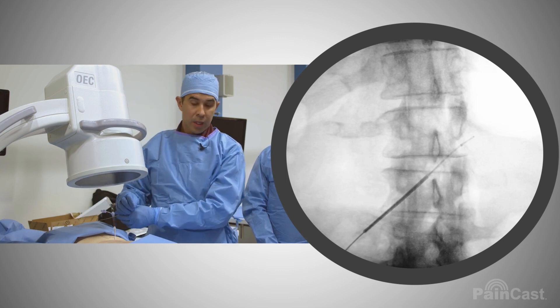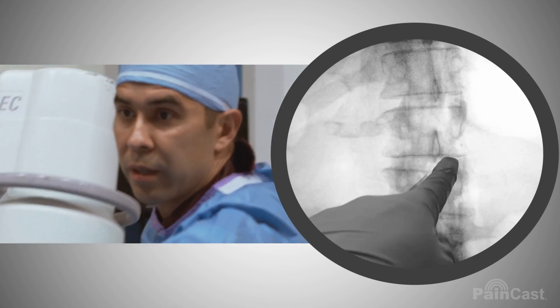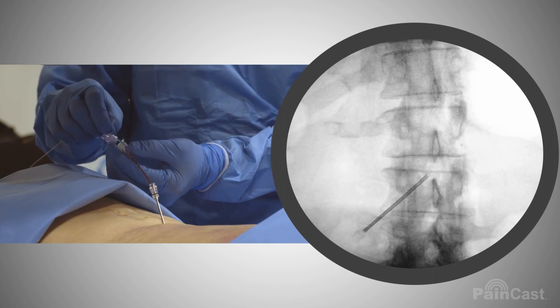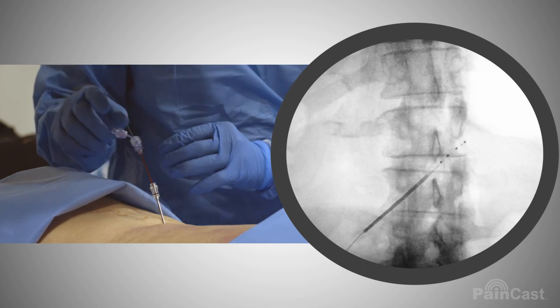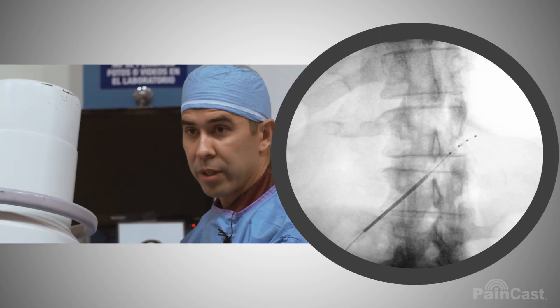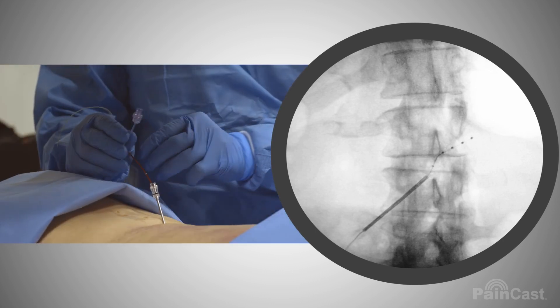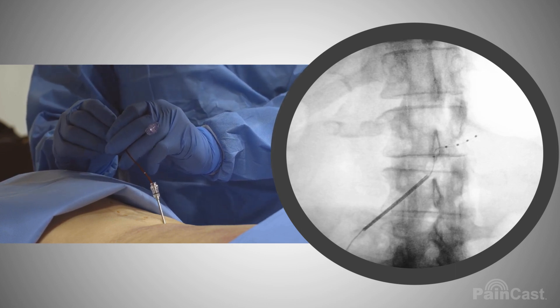We're parked at the entrance of the foramen. You can see that little dot right there is the end of the stylet of the introducer. We're going to advance the lead — you can see we're coming out. Advance a little bit more. It's taking a rostral angle, which is okay. We currently have the second and third contact under the pedicle, which is good. I'm going to now advance the lead through.